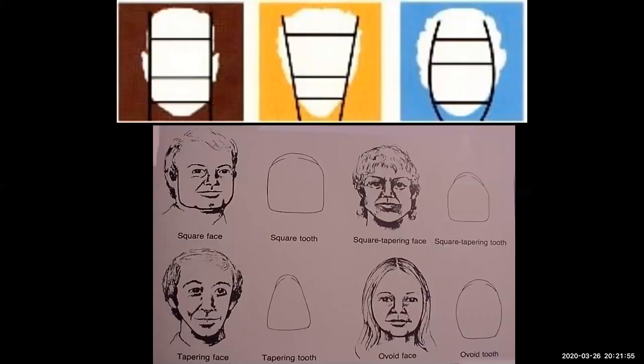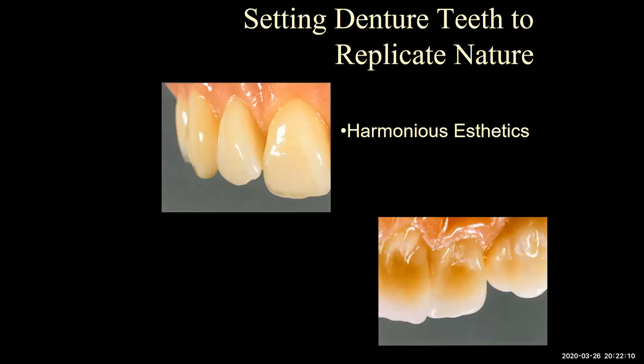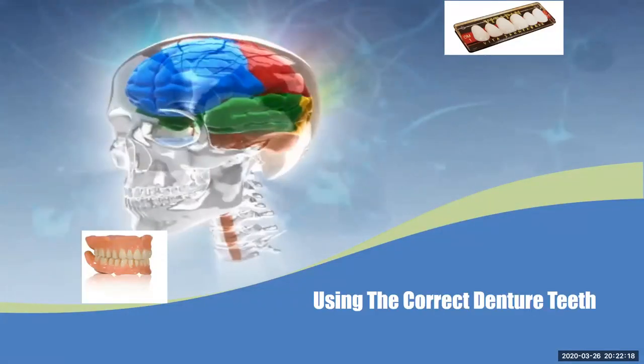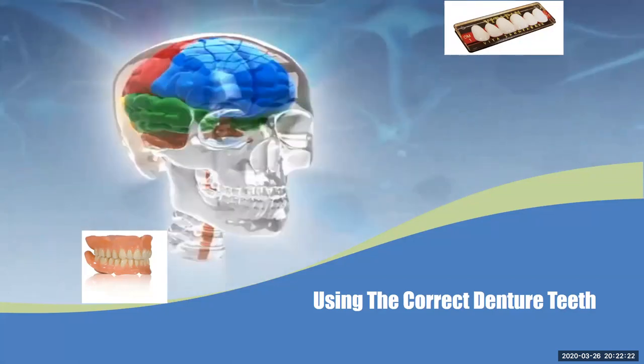Again, these are old photos, but I like to show them just to get the point across that usually face form equals tooth form. The tips of the canines are usually equal to the width of the nose, and the width of the centrals are equal to the width of the philtrum in many instances. We want to set our denture teeth to replicate nature in a harmonious aesthetic effect. But we also want to use the correct denture teeth. And we'll talk about the makeup of the denture teeth that we're using on digital dentures in a little while.